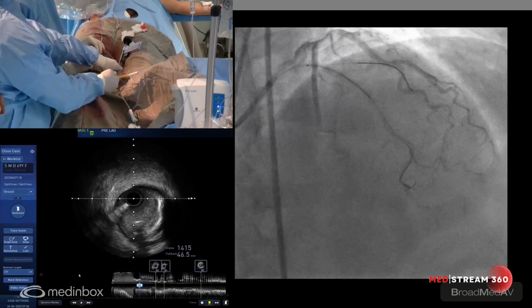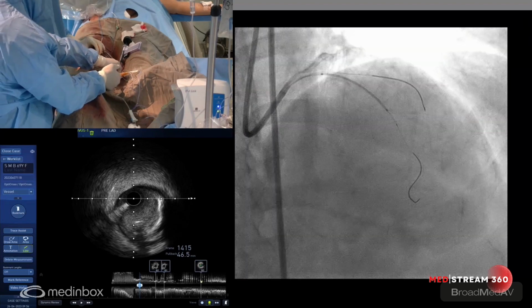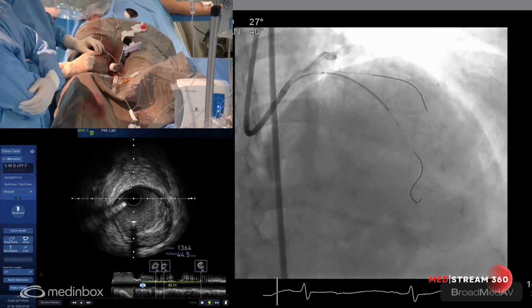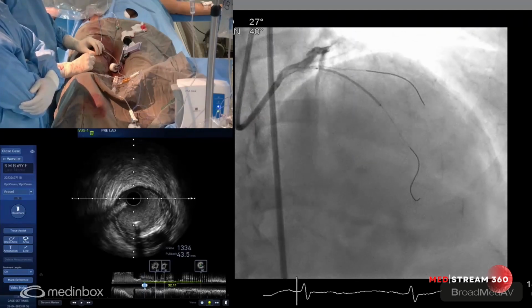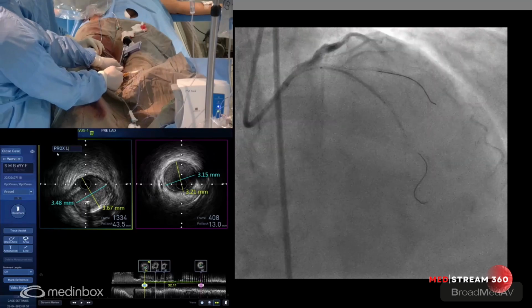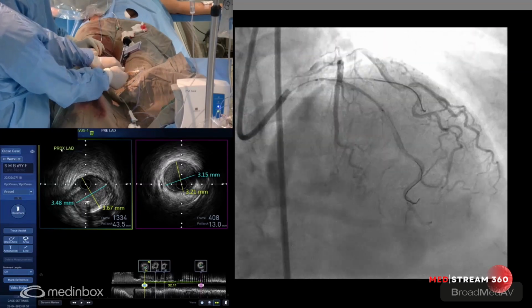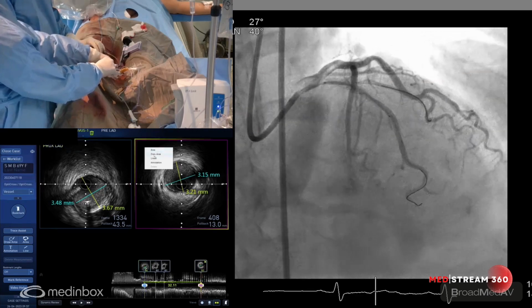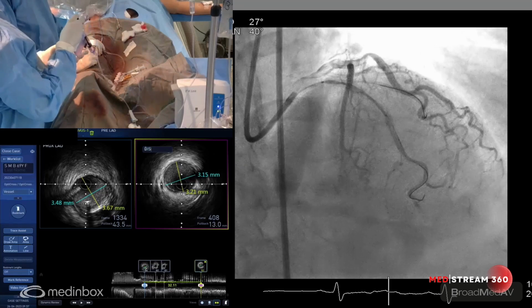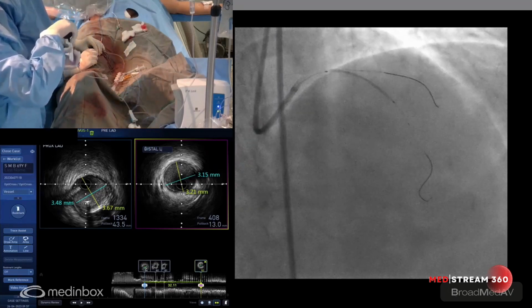Small check. So that looks good, we may take a cine. I think we have covered the proximal lesion well, slightly in. Yes, I think this should do. We'll take a small cine check over here. Okay, let's take a cine. Okay, that looks good. Let's go up, please. Keep the 3.0 balloon slightly prepped, please. Yes.